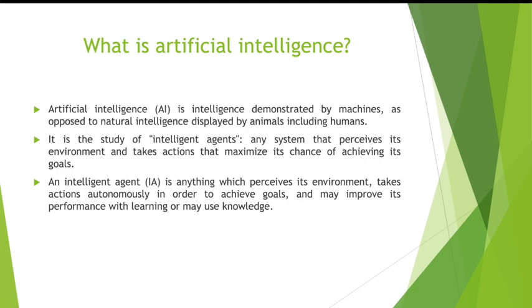Artificial intelligence software packages take their actions autonomously. They are not specifically instructed to do one particular task. For example, in computer programming, you write a computer algorithm and you specifically instruct it to perform a particular task. This is not the case in artificial intelligence. The computer program is not specifically instructed to do one particular thing. Rather, it comes up by itself with what to do. It knows that this is the input that has been fed to it, this is the desired output, and then it comes up by itself with what to do.